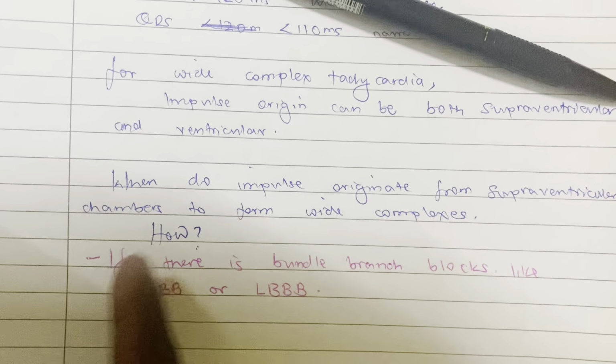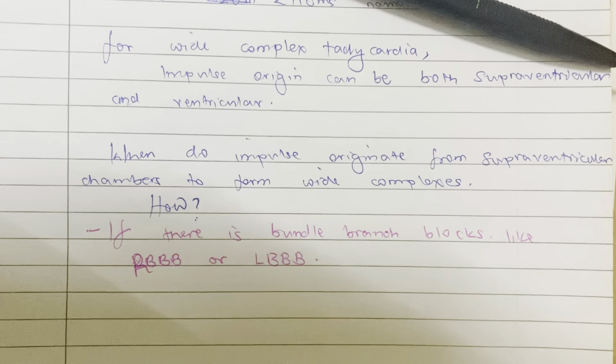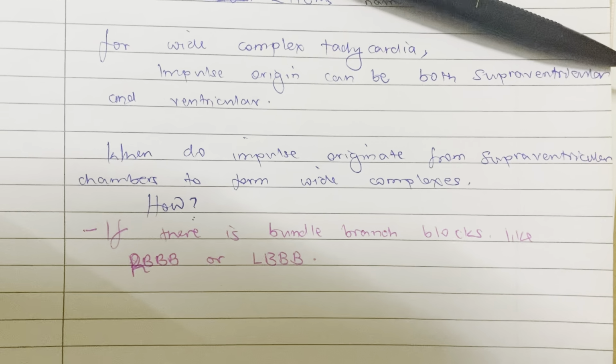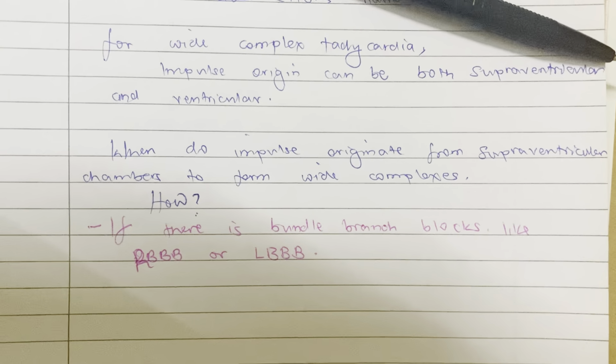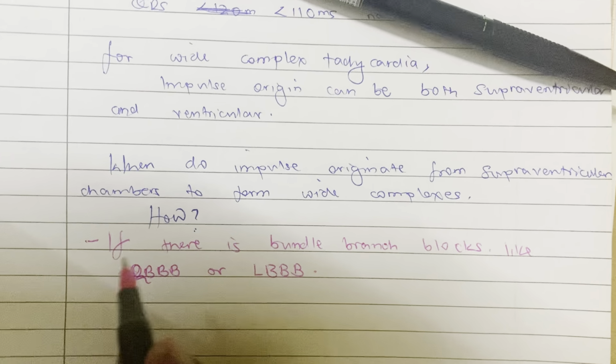So in case of this one, it comes as a tachycardia, and then there is RBBB or LBBB. Then we are going to form a tachycardia with wide complex.